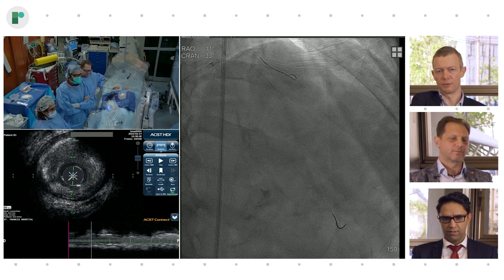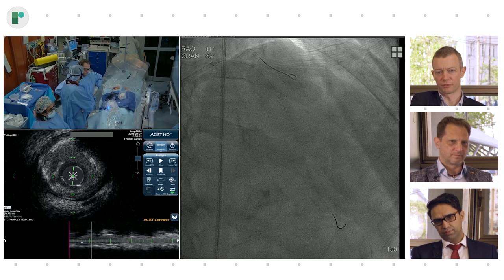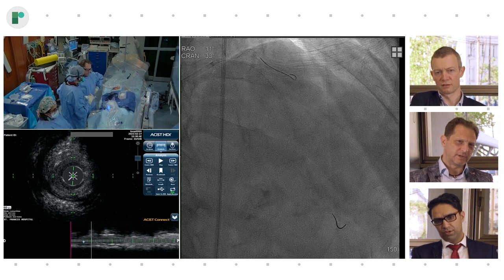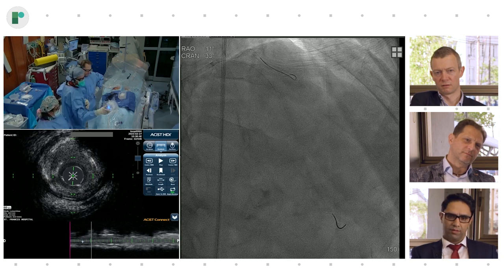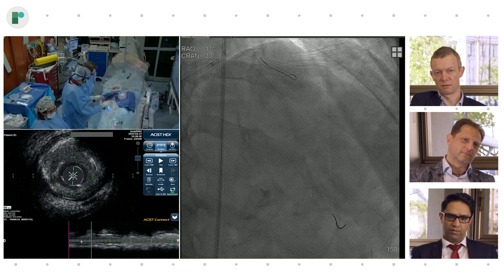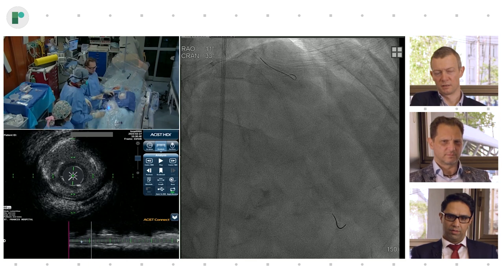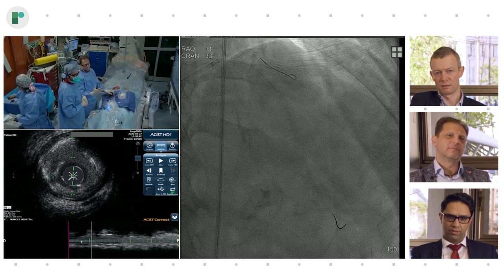You guys don't have drug-coated balloons. Could argue that that could have been a theoretical strategy in these diffuse small vessels. So there's something going on up here too, right? Proximally? At that place, we'll take a cine and do an injection at the same time, and we can delineate how bad that is. Okay. But is the IVUS going to be holding the flap back, you think? No, we'll be able to see it, I think.